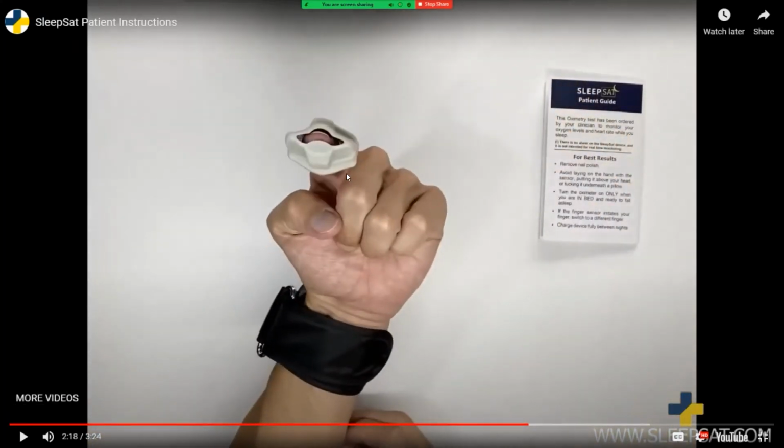All right, I do just want to pause, and your finger should be touching this little bump of silicone. It should not be folding it over, and your finger should not be floating in the middle of the probe, just barely touching this bump of silicone.